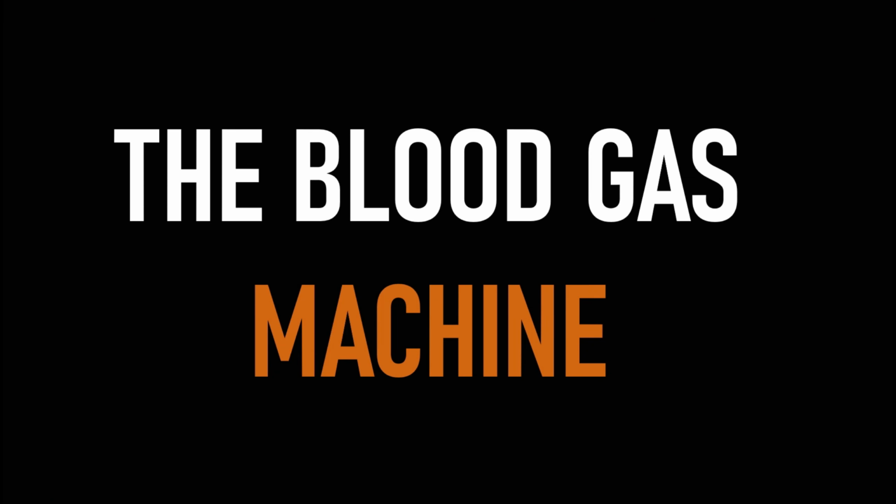Now that I've explained all three electrodes, the oxygen electrode, that's the Clark electrode that I discussed in a previous tutorial, and the glass electrode that's used for CO2 and hydrogen ion activity in this tutorial, let's see how these are utilized within the blood gas machine.